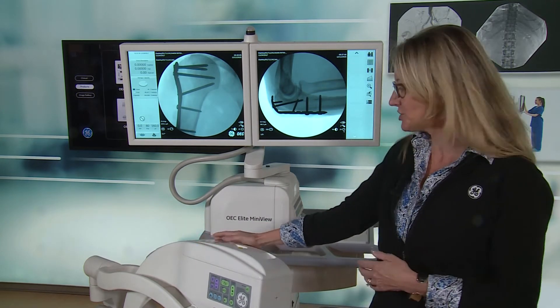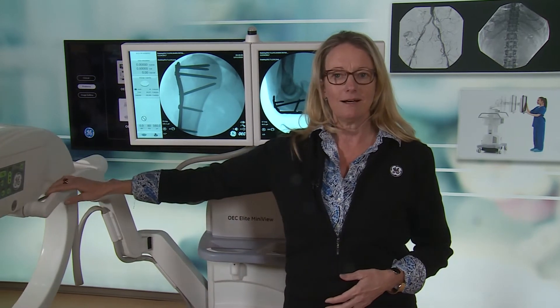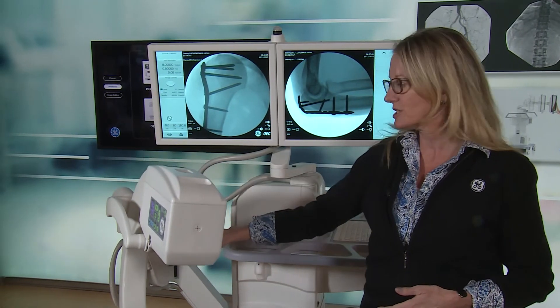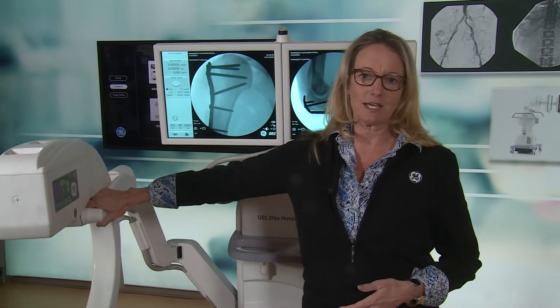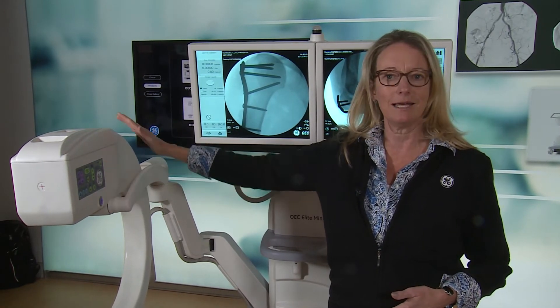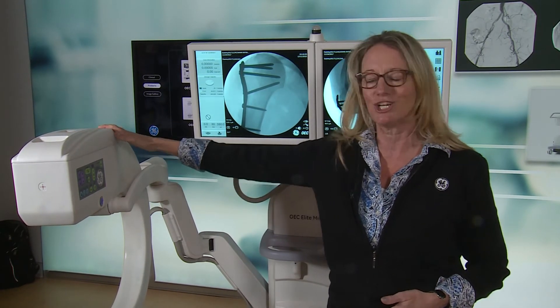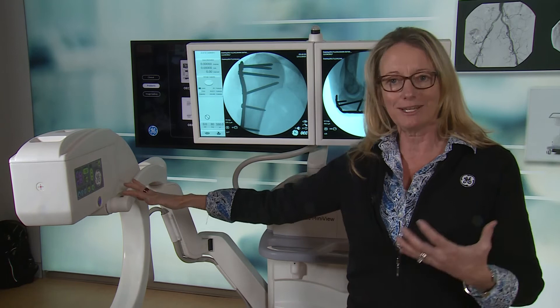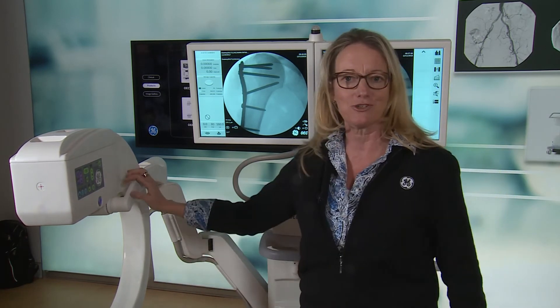Another enhanced feature unique to the OEC arm is it's a balanced arm made out of carbon fiber that easily stays and goes into position. It also features a smart lock, giving the surgeon control to press the button and place it into position without having to do multiple locks — allowing the surgeon to stay in surgical flow, in control, and proceed with their surgery in place.